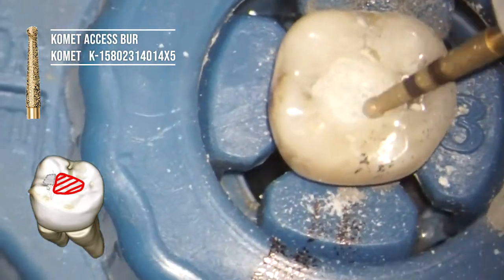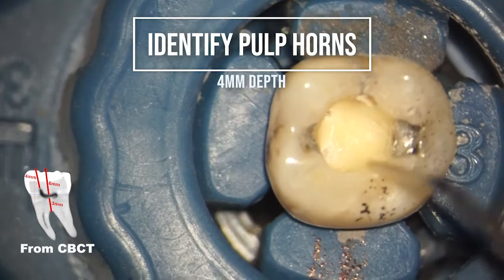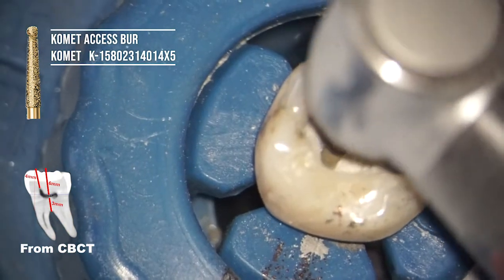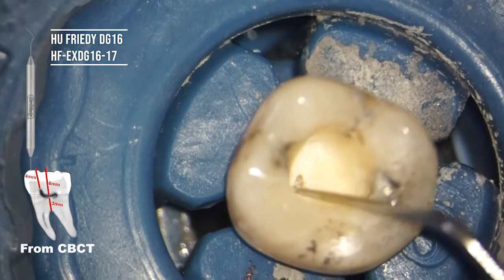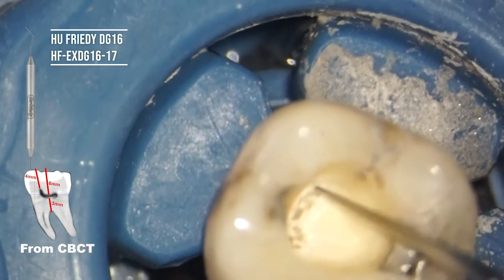Right, at the 4 millimeter mark we can start to see the pulp horns. Sure enough, just a little bit over 4. Now I'm going to take this down to 6, and I should start unroofing the pulp chamber and moving into removing those calcifications. So let's just see if that's what we see. Really sharp, DG16 is wonderful for doing this kind of prep, and just scratching away just to confirm and make sure we're on the right path.